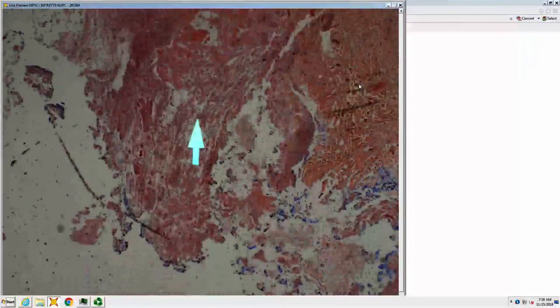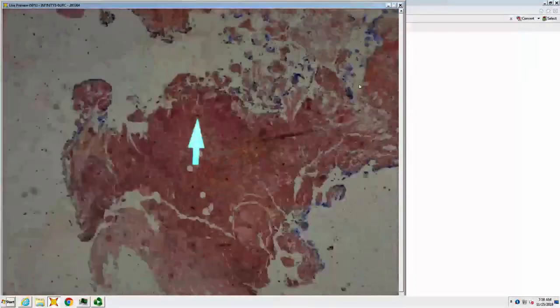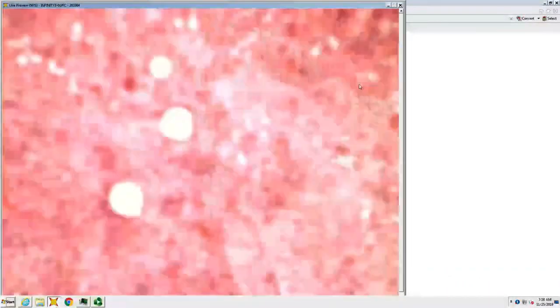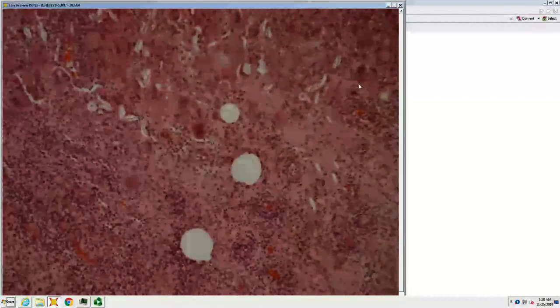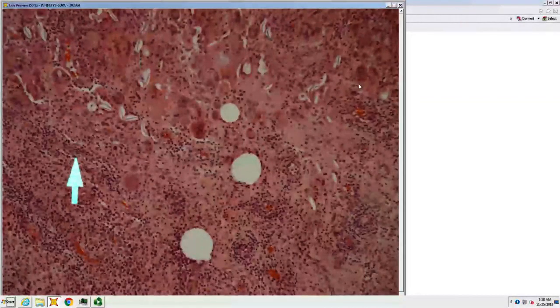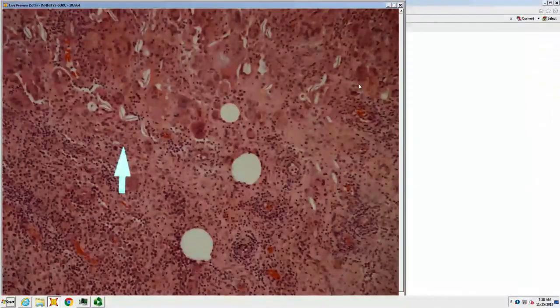It's big and red. Giant cells. Ooh. Is that keratin? Yeah, so like this in cysts? A ruptured EIC.